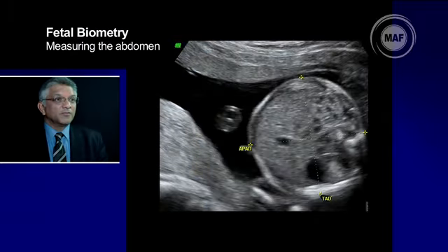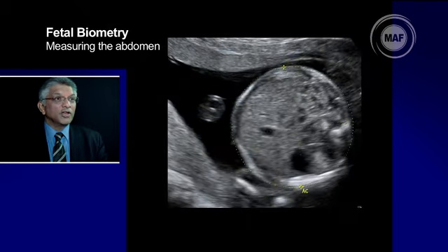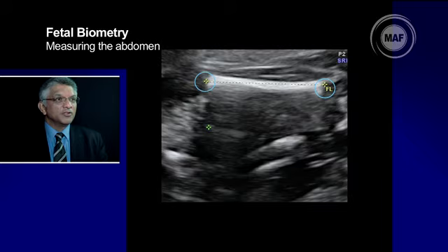The abdominal circumference. Okay. You should see part of a rib, and you should see the umbilical vein 1/3 way in. That's your correct section. And you can measure transverse of the abdomen and anterior posterior measurement. And those two caliper placements will give you the abdominal circumference, or you can use the ellipsoid method. That's the femur. To measure the femur length, you should measure the shaft only, and both the edges should be blunt, and you measure the outer as near as possible.